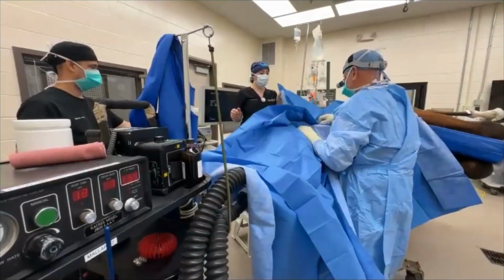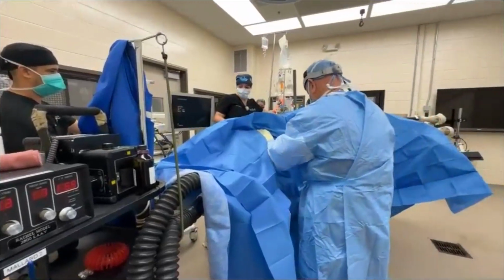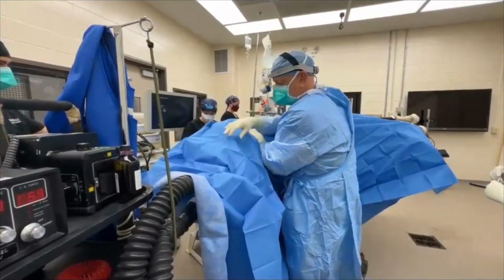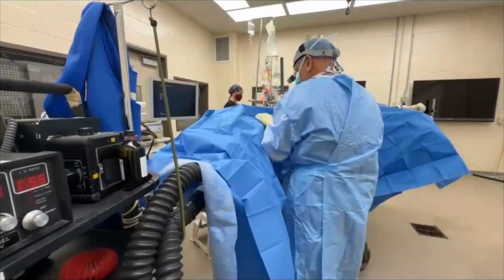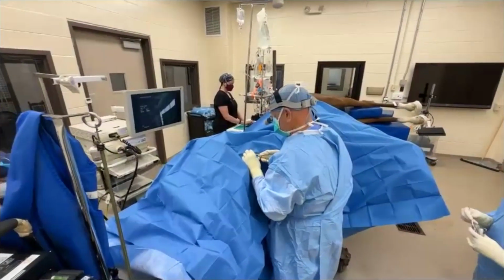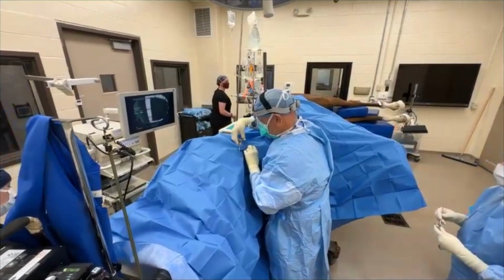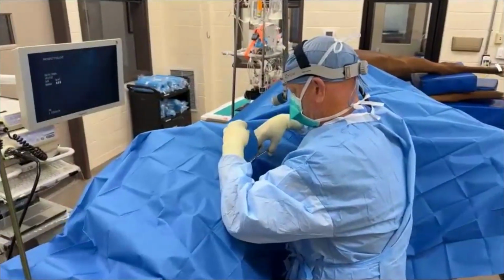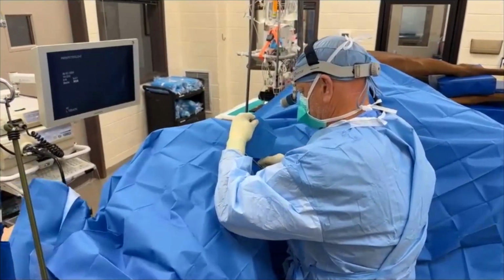I call these the surgical cloth. It feels like you've got two layers of it on the horse. Yeah, they're paper drapes. They've got holes in them, and they're disposable. I think most people now use disposable rather than actual cloth drapes. So it appears that you're just opening up the cloth to have your targeted area. Exactly. All I have exposed is the surgical site.